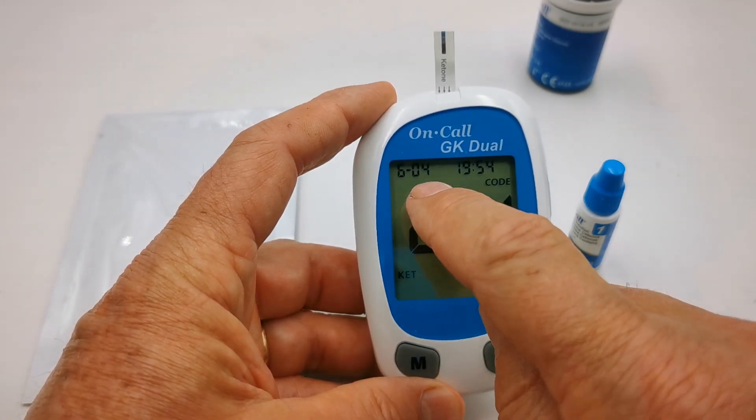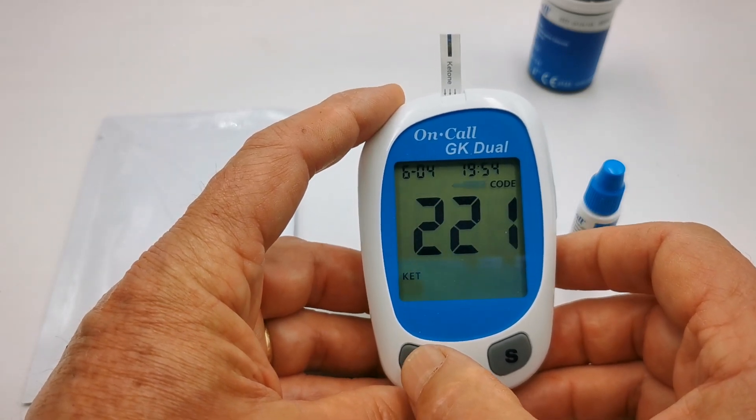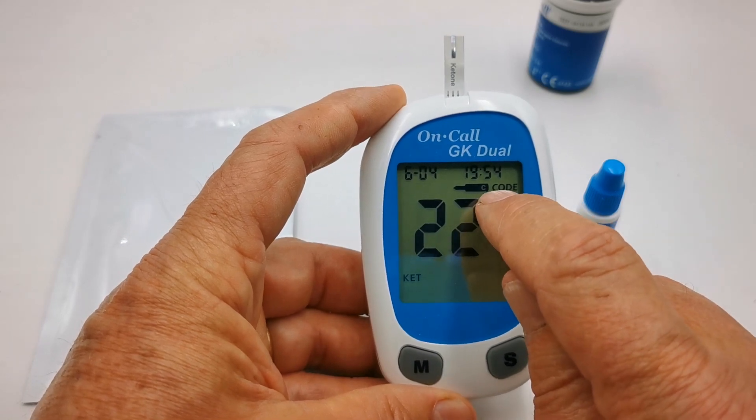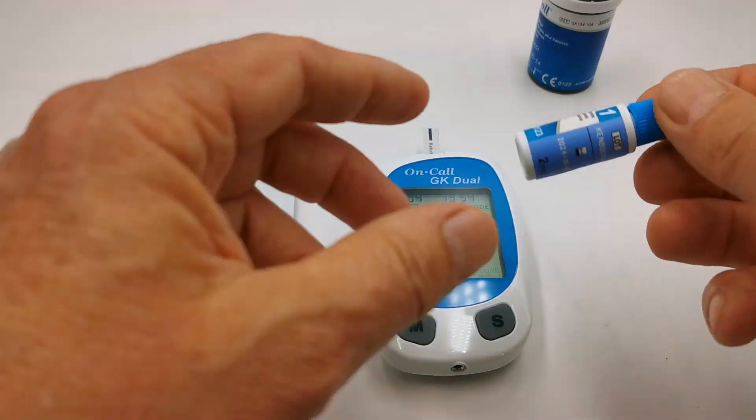The strip is now recognized, but it's in test mode for human blood. We want to test the control solution, so we just need to press the M button once and you'll see the code with the test strip coming up. That indicates that it's now in control test mode.